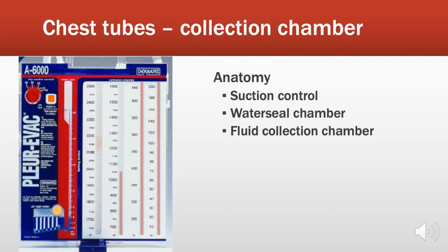So this is what it looks like as it starts to fill up. Blood will go into the chamber and you see the orange box on. And that's what you're looking for every day when you come in. The other thing that you're going to be looking for is any bubbles flowing through the blue fluid of the suction of the water seal.